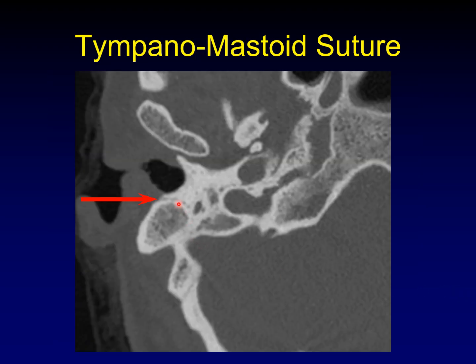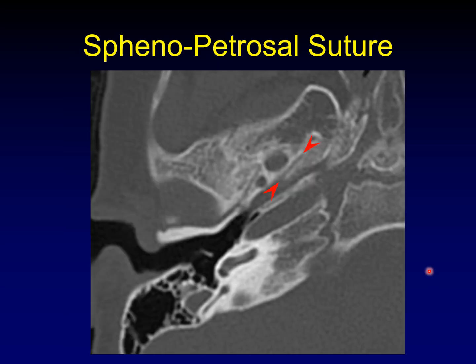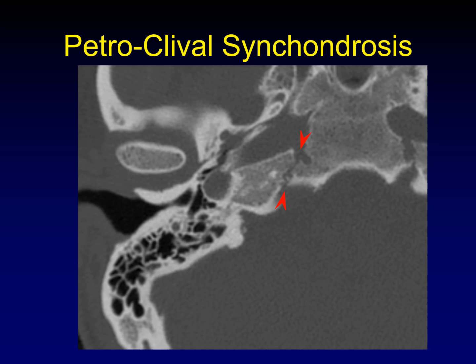Here's the tympanomastoid suture that runs posterior and parallel to the external auditory canal. Here's the tympanosquamous suture — this one's hard to find, and it is running behind the temporomandibular joint but in front of the external auditory canal. The sphenopetrosa suture runs posterior to the foramen ovale and lateral to the eustachian tube. Because this is running along the course of other major anatomic structures like the eustachian tube and the petrous segment of the internal carotid artery, it is frequently mistaken for a fracture. And a crowd favorite: the petroclival synchondrosis, just lateral to the upper clivus, and it's as famous as the origin of clival chondrosarcomas.